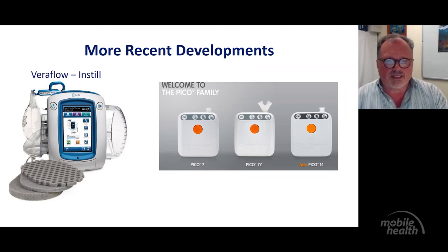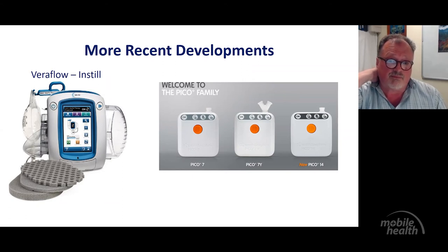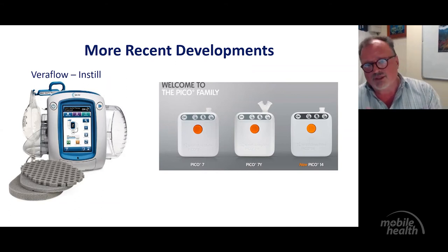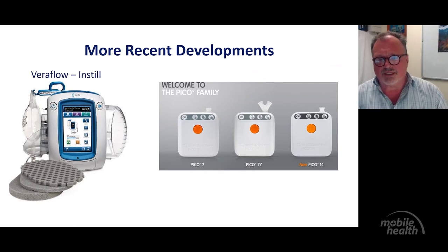So that's promising. On the other side is just to show you the PICO development. But people develop other devices like Prevena and other spring-loaded devices, even without batteries. These PICO systems are battery-powered, so they're disposable. They're $200 to $250 per week, depending on your contract, all right? And so it's significantly cheaper than standard negative pressure, and more convenient for the patient.